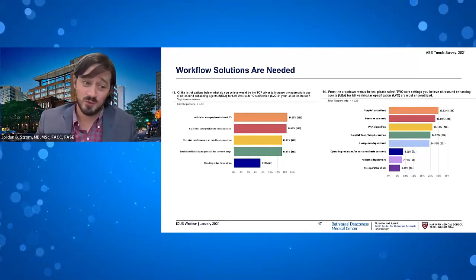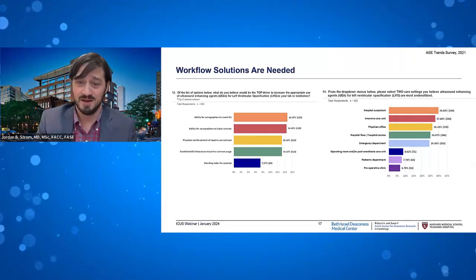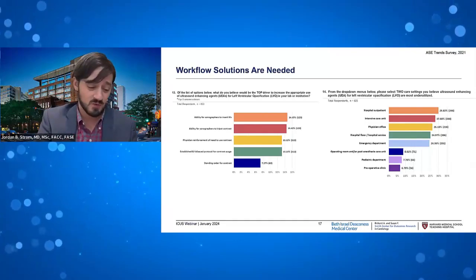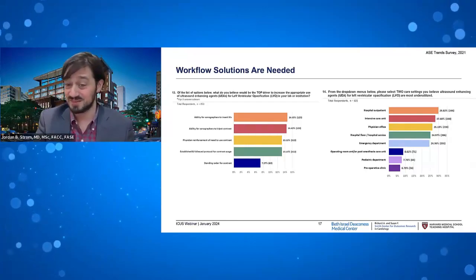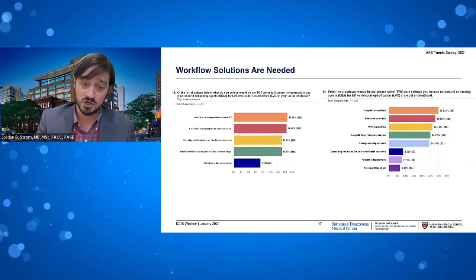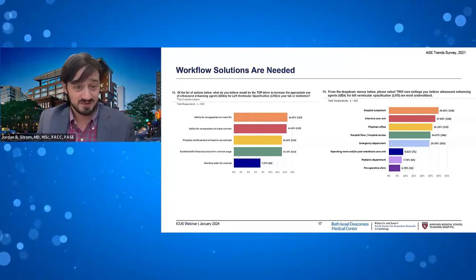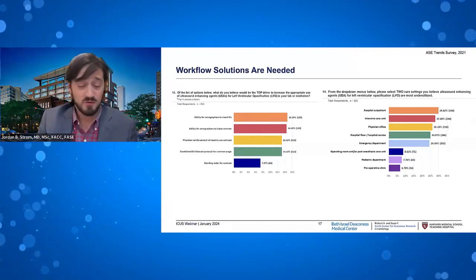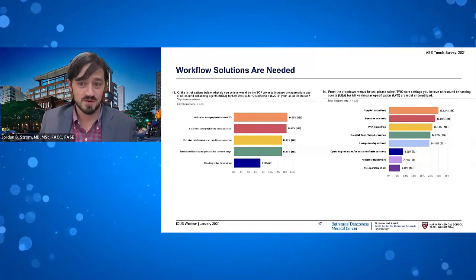Well, patients don't come to us with IVs. And so you have to place an IV, and I certainly can tell you at our institution, you look at the images, you say, oh, this is suboptimal image quality, I'm going to need contrast. A call for an IV nurse, place an IV. Sometimes that process can take up to 30, 45 minutes. If you have an hour-long study, then that really is prohibitive in terms of your use of contrast.